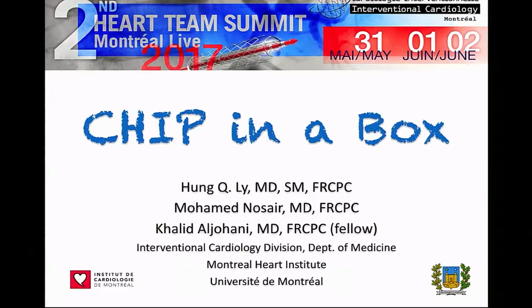So this is a CHIP in a box. The patient that we were supposed to do today was actually reviewed again by advanced heart failure, and they decided to consult transplant, so that's where we are today. So we ended up troubleshooting and finding a CHIP in a box case that Mohamed and I did about 2 weeks ago.